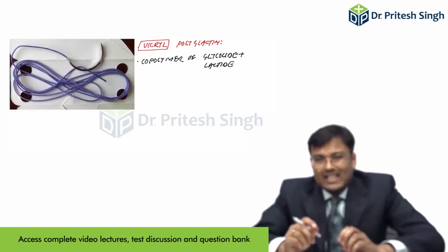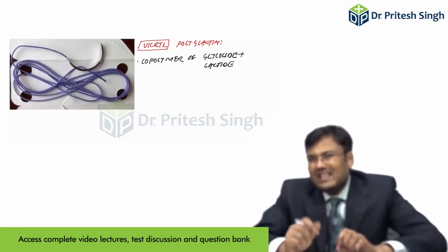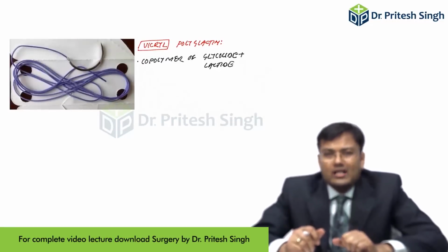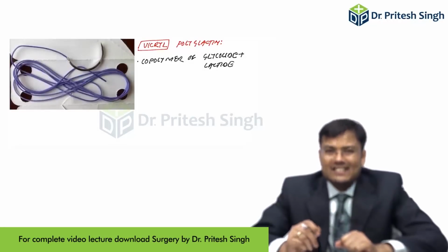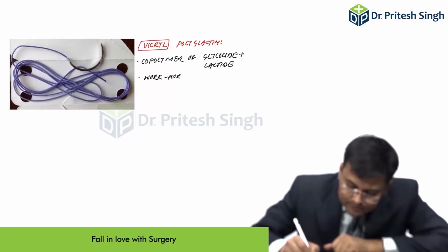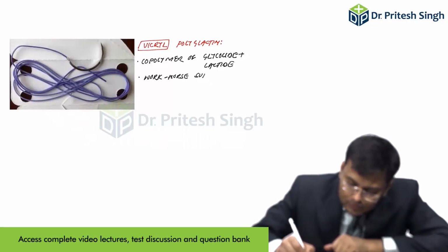And you must know that general surgeons use this suture excessively. That's why it's known as the workhorse suture for general surgeons.